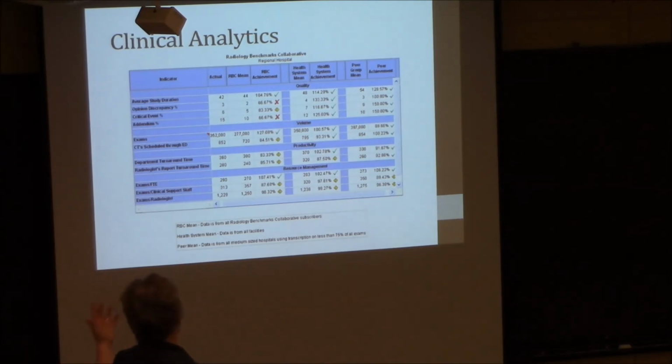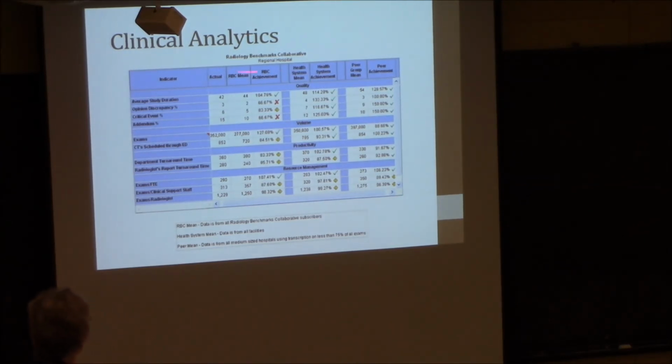And then finally, out of that, the expectation is that you have this thing called clinical analytics. And so I can, on any given day, say, how long did it take to do a certain study? How long did it take for me to report it and get it to the patient record? And were there any critical events during it? How many contrast agent reactions did I have? Those sorts of things. So you have these nice little dashboard analytics that your chairman can look at during the day and say, what's going on down there? You guys are getting way behind.